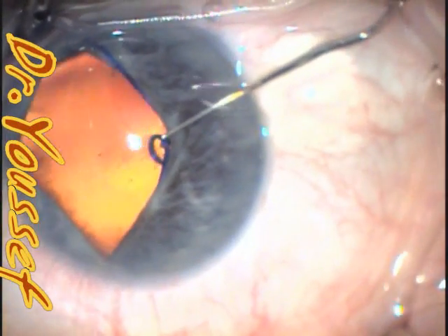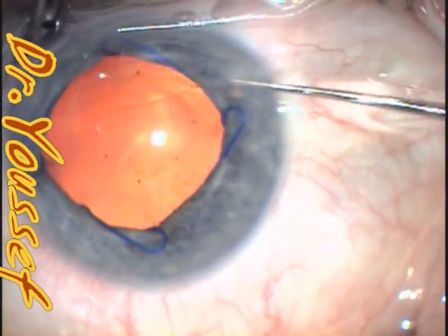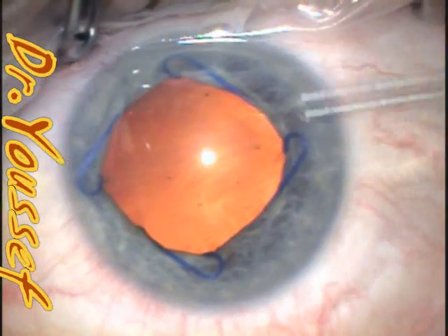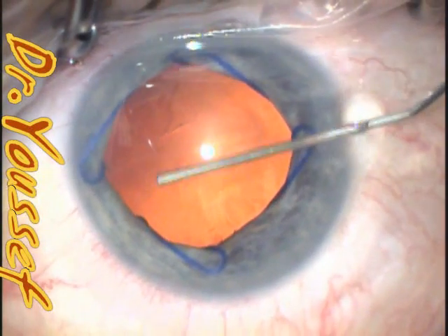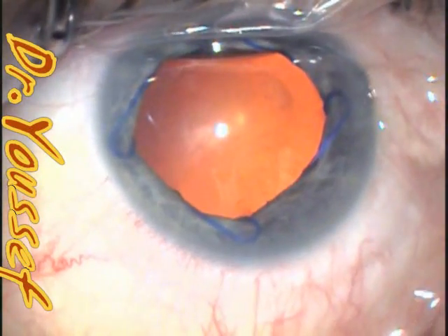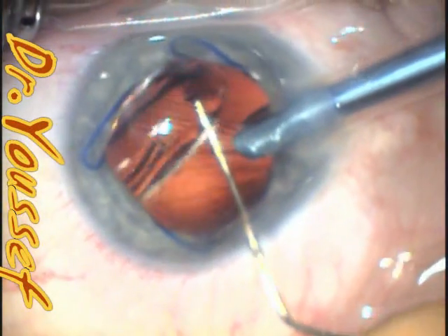This way it's well controlled. Since we did not over-inflate the chamber at the beginning with the viscoelastic, it's now time to inflate it well so that you push the iris back against the lens and try to avoid floppiness during the procedure. I now put more viscoelastic on top of the iris — not just at the center of the pupil — to stabilize it and avoid it from jumping around.